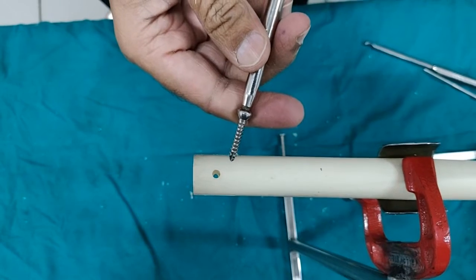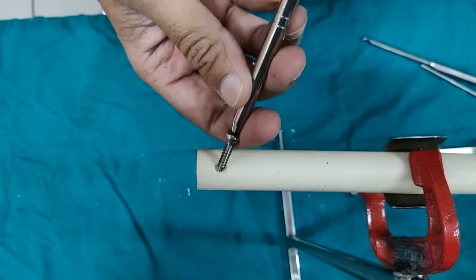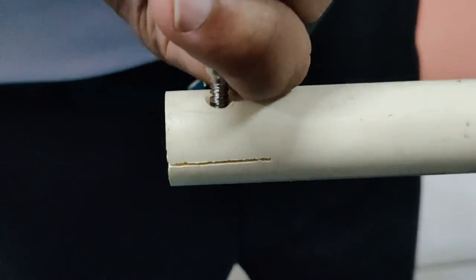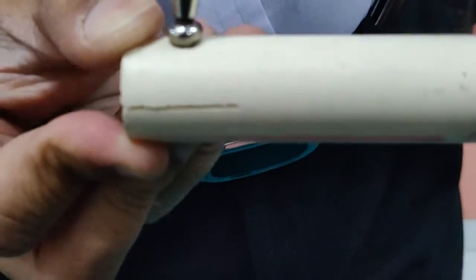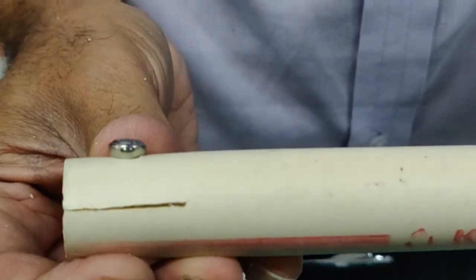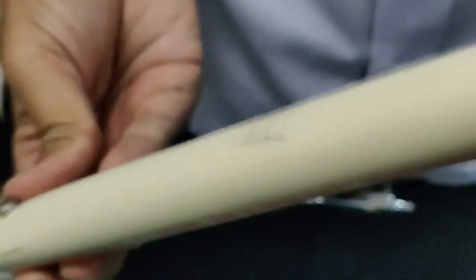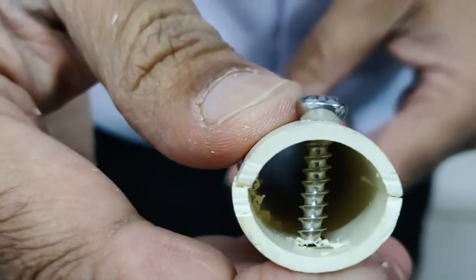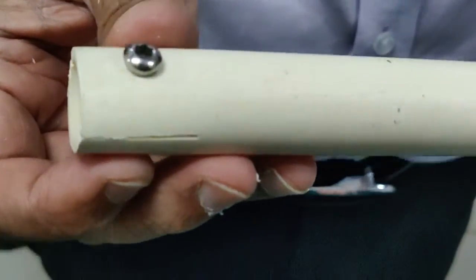After the countersink, this is followed by measurement of the screw size, then a tap — in large fragment we use a 4.5mm tap. This is followed by putting the right size screw. You can now see that this has compressed the fracture site. On this side the pipe cross-section was round, but after compression it is almost elliptical — this is a good demonstration of compression at the fracture site.